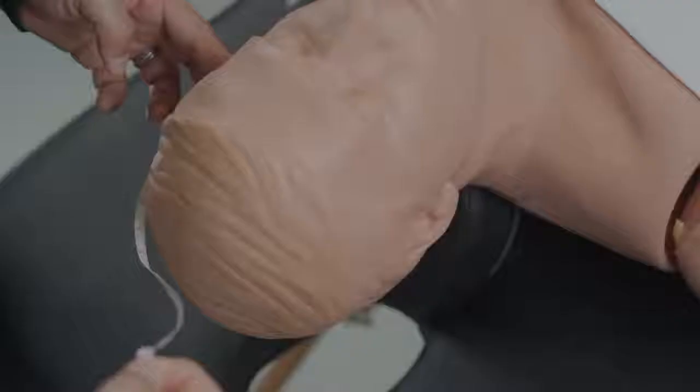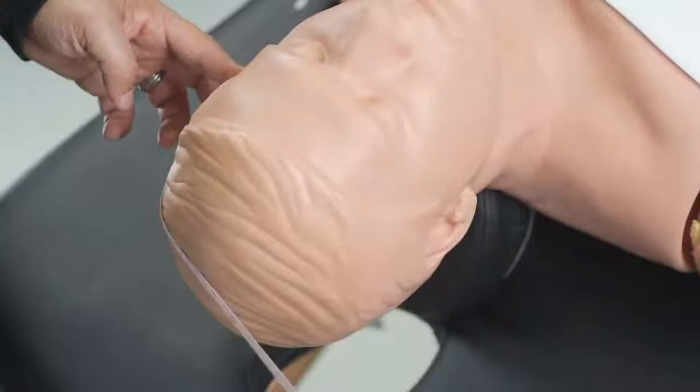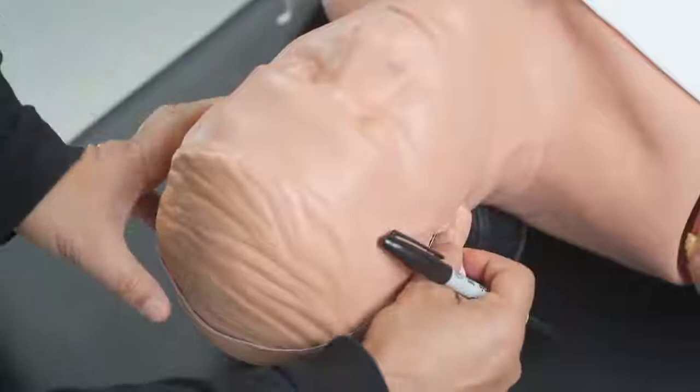The next step is to measure the distance from A1 to A2 — from in front of the left ear to the right ear — and find the midpoint, which is half that distance. We cross that midpoint with the CZ line, and this crossing point is your true CZ point, which we then mark.